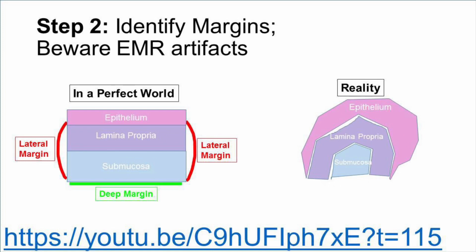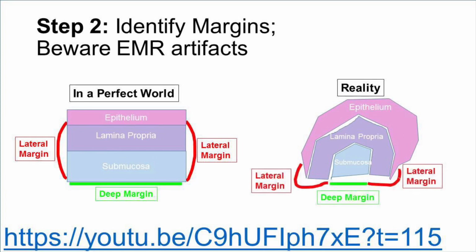In these cases, your lateral margin is actually off to the side pretty deep, and your deep margin is here. So how I approach these cases is find where your submucosa is, and the area that binds that is going to be your deep margin. Your lateral margins will extend from your deep margin to the surface. Check out this video if you want to see how a real EMR is performed.